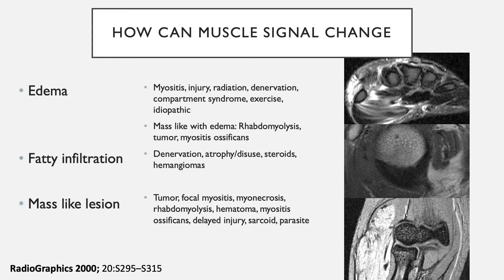Let's look at how muscle signal can change. Edema is diffuse T2 signal hyperintensity, best demonstrated on fluid-sensitive fat suppressed images, and can result from myositis, injury, radiation, denervation, compartment syndrome, exercise, or other idiopathic lesions. You can also have a mass-like abnormality with edema from rhabdomyolysis, tumors, and myositis ossificans.